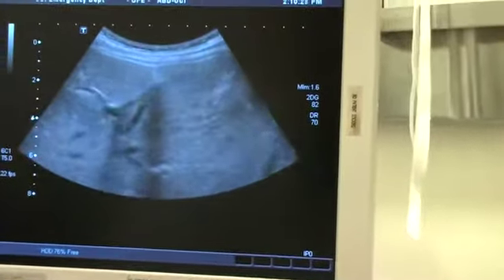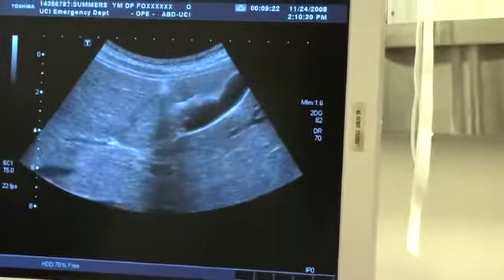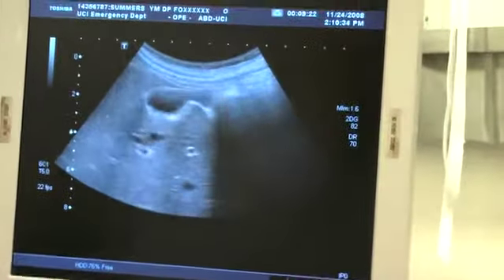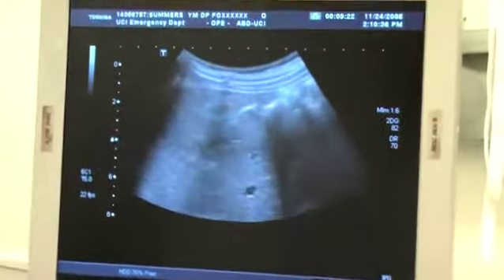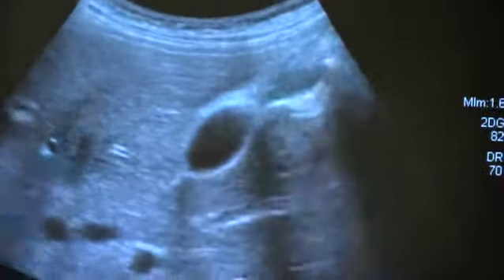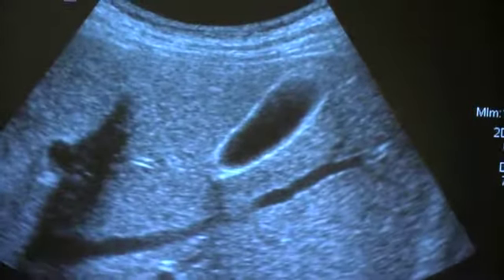I'm going to go 90 degrees, and now I've got a transverse view. I'm going to fan through the transverse view of the gallbladder and make sure I don't see any stones in all planes. Okay, and then now I'm going to show you guys really quickly how to get the common bile duct. You want to breathe? Okay. Whenever you're ready.